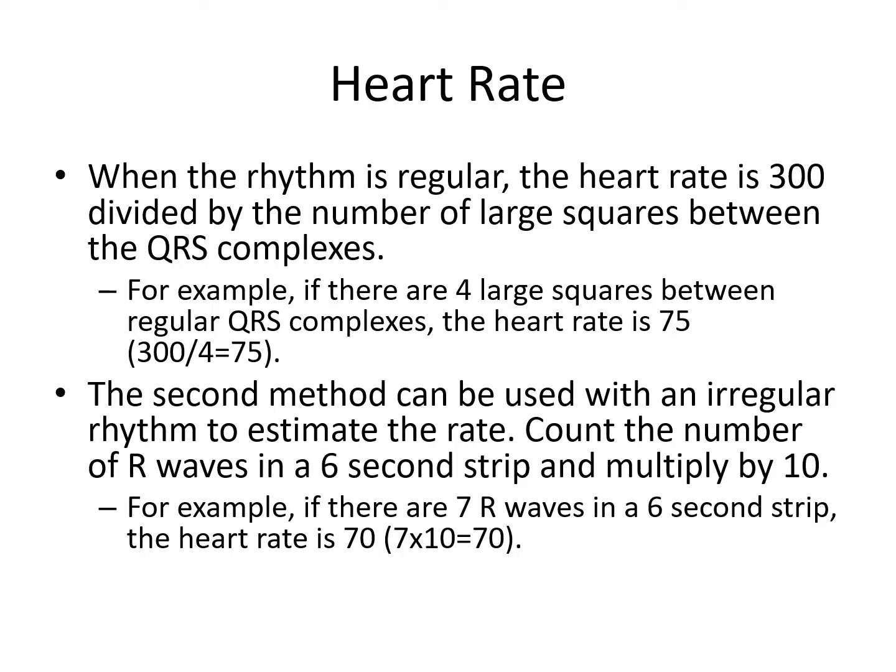Now that we have some foundational knowledge regarding EKG components, let us begin the steps needed to interpret our tracings. We always begin with calculating the heart rate. Okay? When I talk about calculating the heart rate, I mean getting a rough estimate of the heart rate by glancing at the EKG strip. Okay.